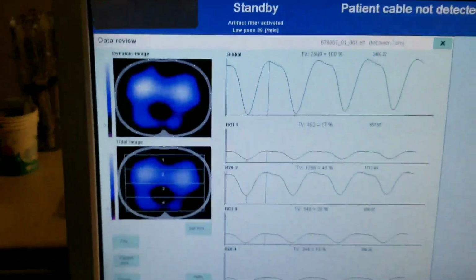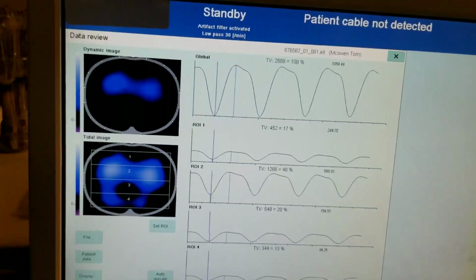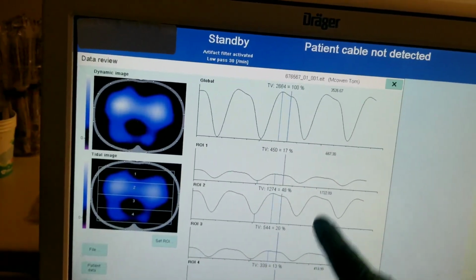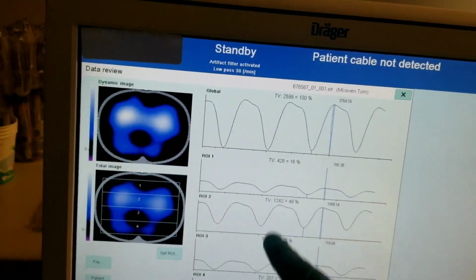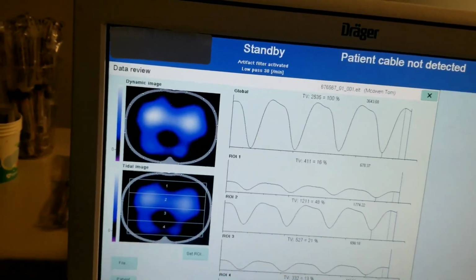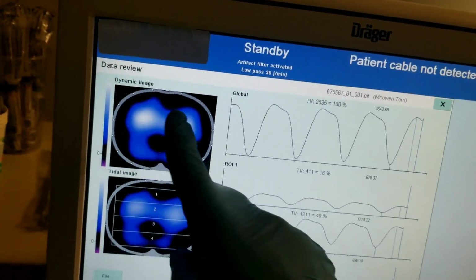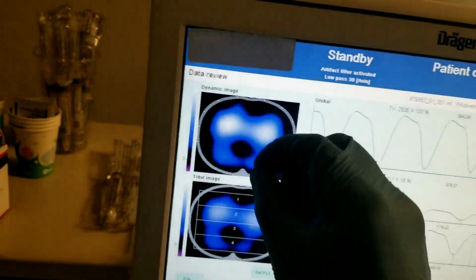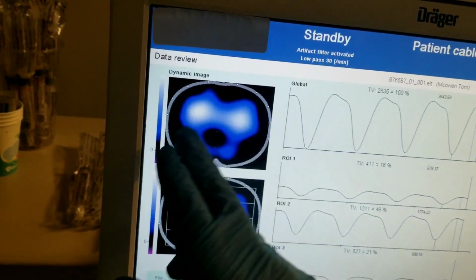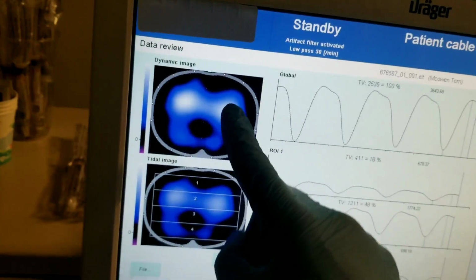This is what his tomography looked like in the recovery room. So there is some dorsal distribution, but I didn't film the other one, where we were having trouble. We're often losing the dorsal area, and when we were increasing the vent power, there was maximum ventilation going to the ventral areas. So we're scared that, over the coming period of ventilation, by continually adding pressure to try and keep this open here, we might be over-distending or putting more pressure there.